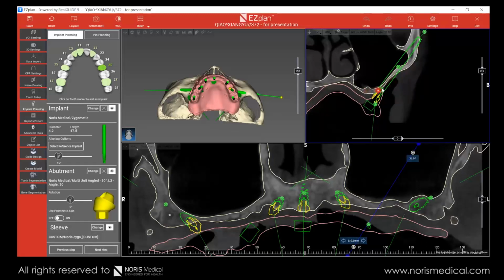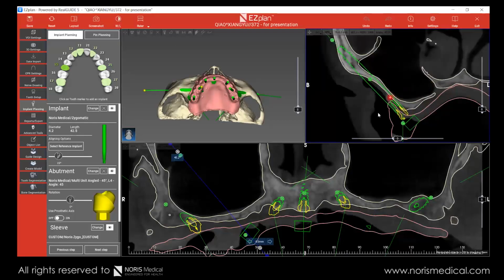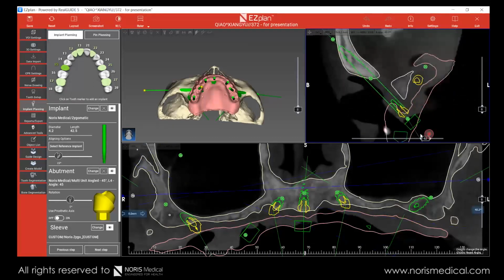This is a very, very thin atrophic maxilla. Okay, and the implant is anchored in the zygomatic bone, and very short location for the restoration here. Okay, because we did not want to perforate toward the palate here. In this case, we did not perforate, and it's better for the future. Okay, let's look at the other side. Typical, but very, very similar. You see, very similar. A little more on the crest. Okay, you can see that.